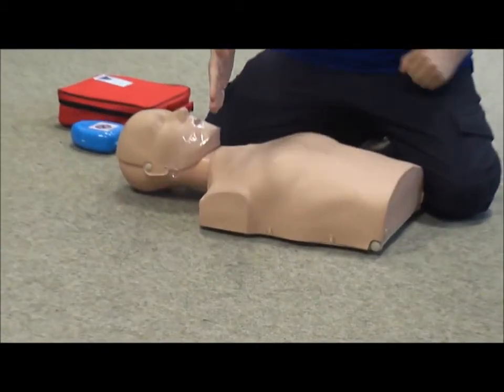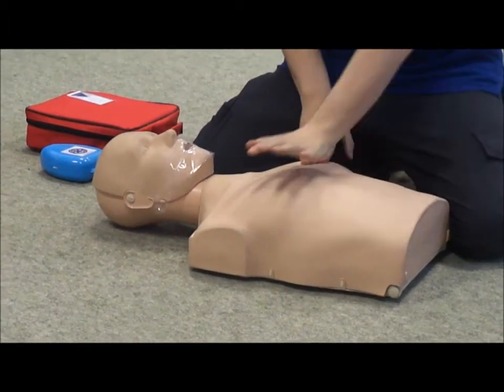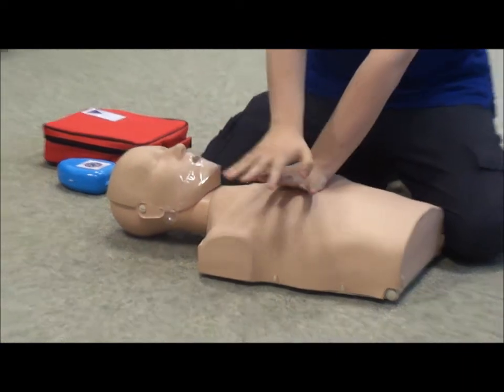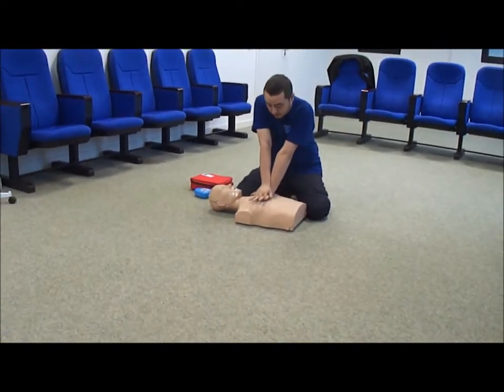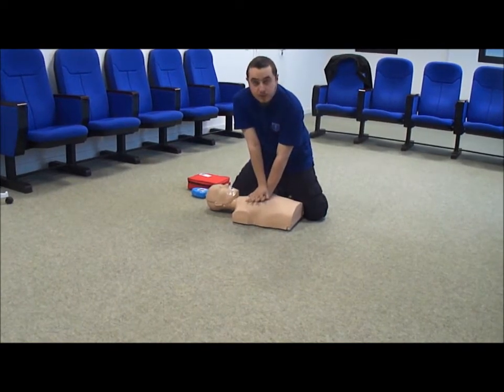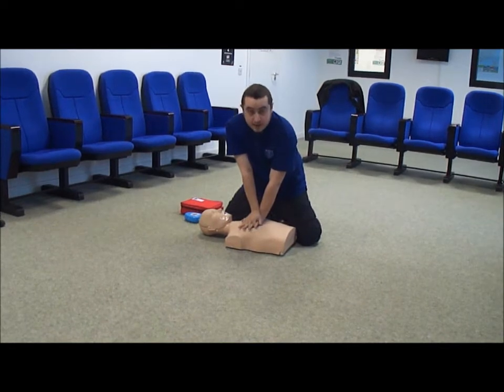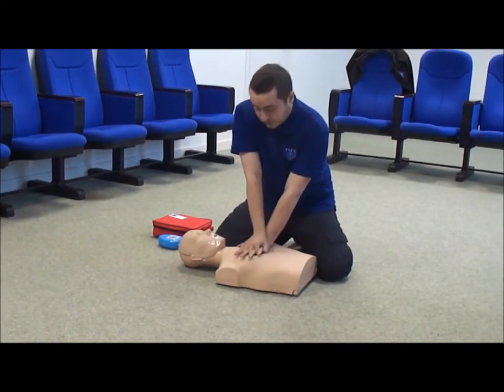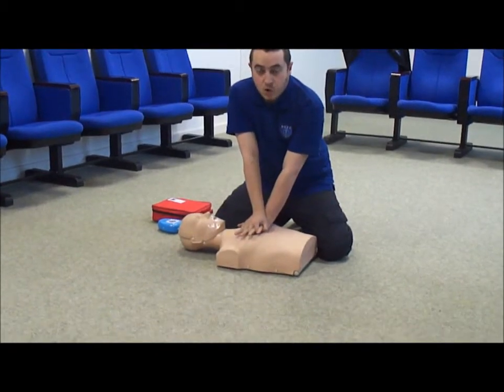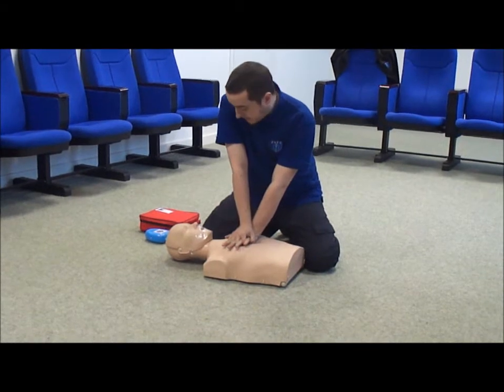The first thing I do is come from under the armpit, find the center of the chest like so, put the heel of my hand down, and interlock my other hand like so, keeping these fingers off the chest if at all possible, at a 90-degree angle above my patient, arms straight, and I start pushing. I push 30 times to a depth of at least 5 centimeters, at a rate of 100 to 120 compressions a minute. So that's deep and that's fast.